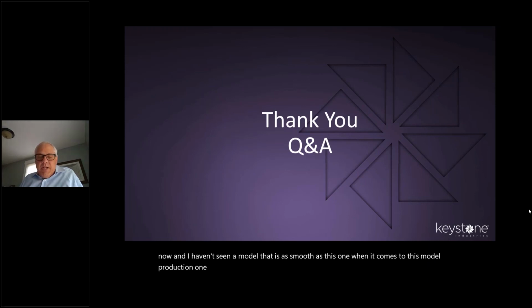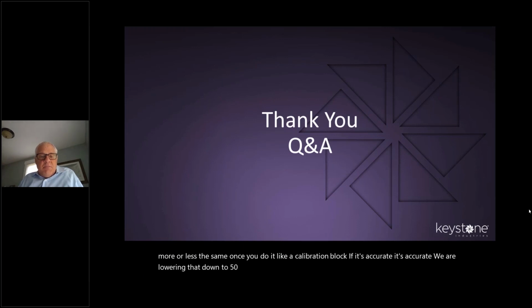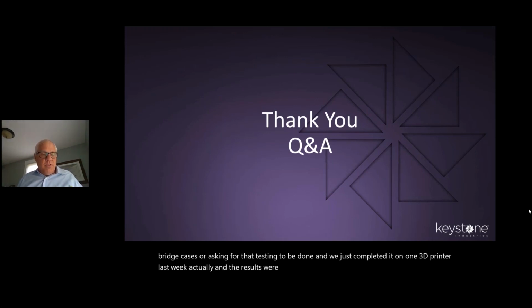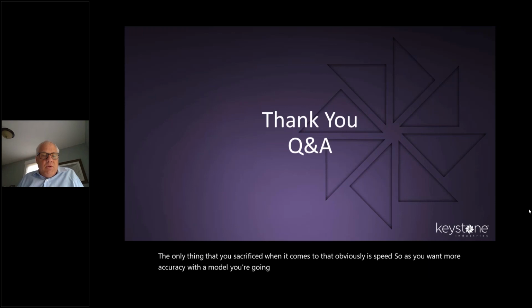One of the things I will say when it comes to accuracy is most of our testing is done at 100 microns, and 100 microns on our model and 100 microns on somebody else's model is going to be more or less the same once you do it like a calibration block. If it's accurate, it's accurate. We are lowering that down to 50 microns in some cases. Some laboratories, especially for crown and bridge cases, are asking for that testing to be done, and we just completed it on one 3D printer last week, and the results were very positive. So no issues with going to a higher degree of accuracy. The only thing you sacrifice obviously is speed. As you want more accuracy with a model, you're going to expect longer print times.